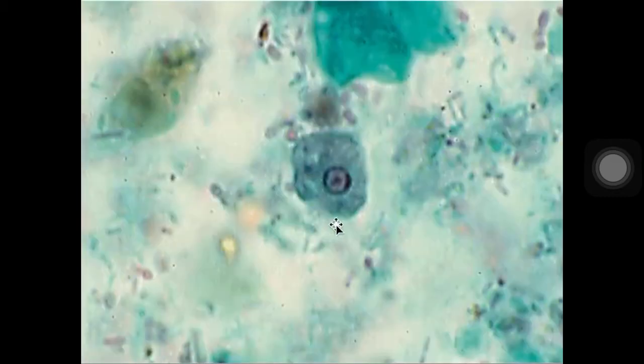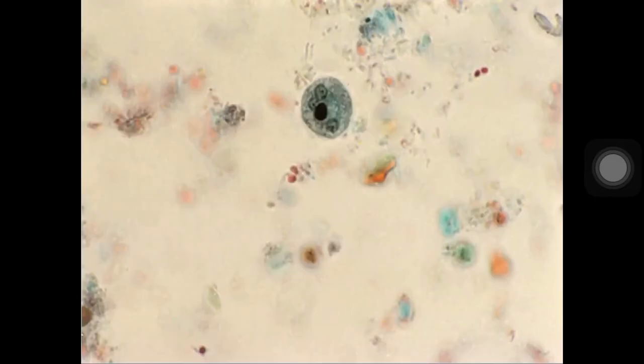And you can see here yung kanyang irregular yung kanyang peripheral chromatin. So unlike po sa histolytica na evenly distributed yung kanyang peripheral chromatin. And then we also have here again Entamoeba hartmanni. Saka wala rin pong ingested RBC ang Entamoeba hartmanni. But this one is Entamoeba hartmanni cyst. Cyst po ito kasi you can see here meron siyang 3 nuclei na present. Tapos meron siyang chromatoidal bar na present dito.